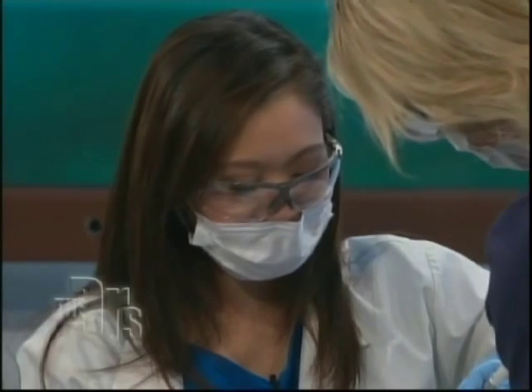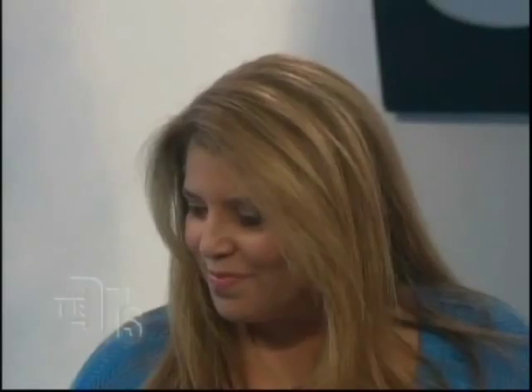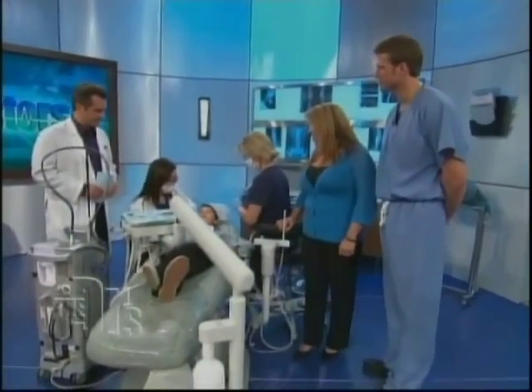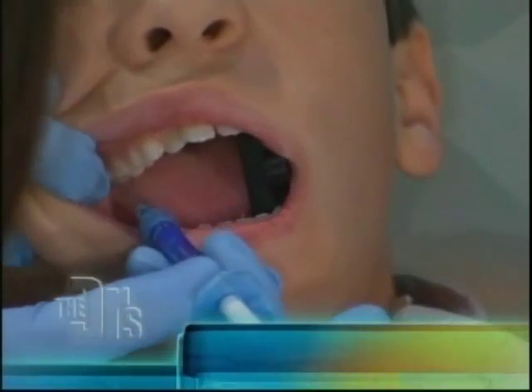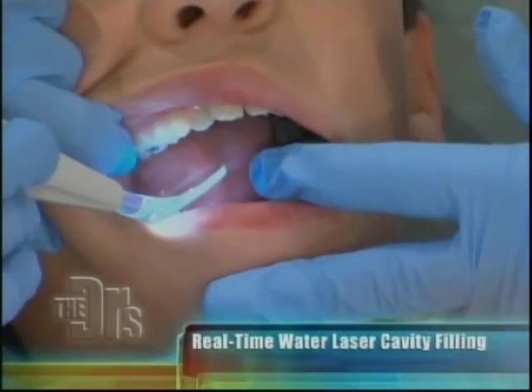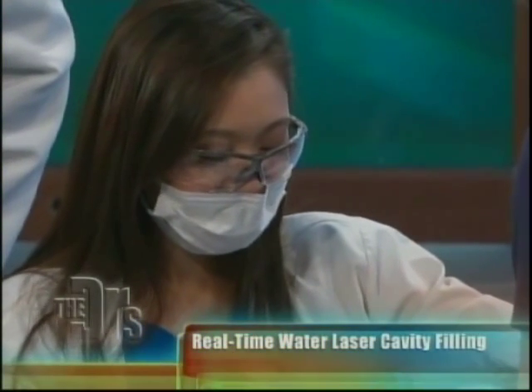This is great. Zach, are you doing okay? All the cavity's gone — now I have a rough, solid, hard tooth. The cavity's all gone. Now we're halfway done. The bad part's gone, and now we have to seal it. This is the easiest part. Zach, we're going to paint your tooth in four different layers. First, we're going to use a material called etch. Etch is like a soap that cleans off the tooth, which is really great. That way, you sterilize the area that you're working on, and you can ensure that your cavity filling is going to last you a lifetime.